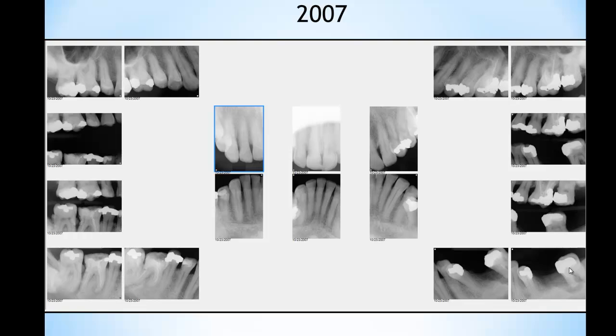least finish the case. As I said, we started this case in 2007, and I referred him to an oral surgeon to extract those wisdom teeth and hopeless teeth on both sides, and do the socket grafting and the implant placement. So the patient slowly starts doing what he was told and followed the treatment. He was very compliant, and to my surprise.